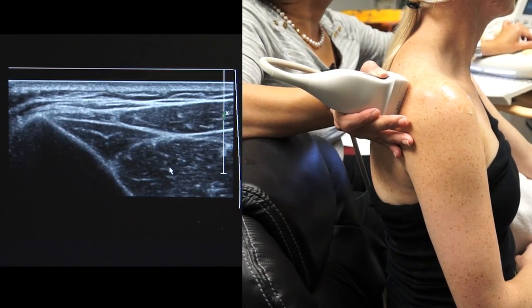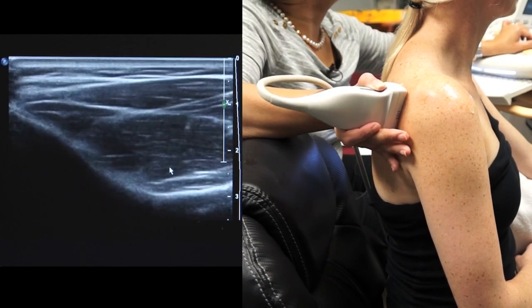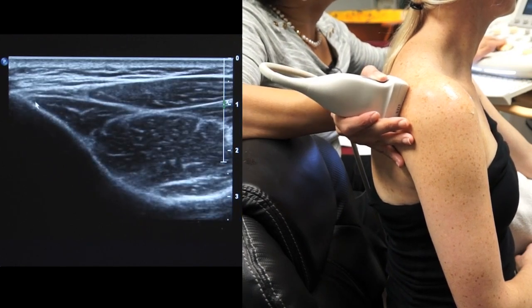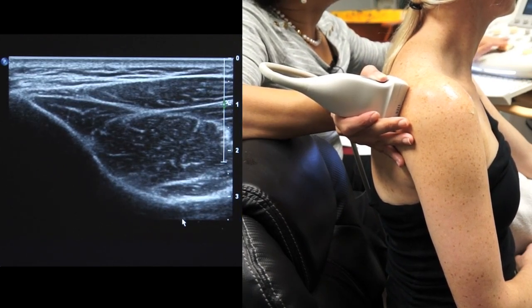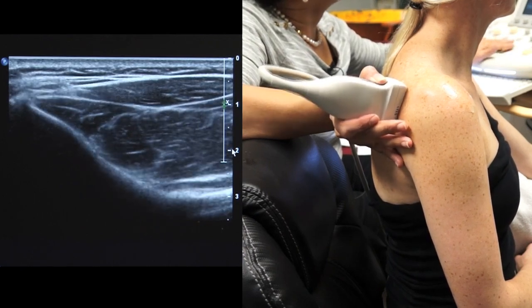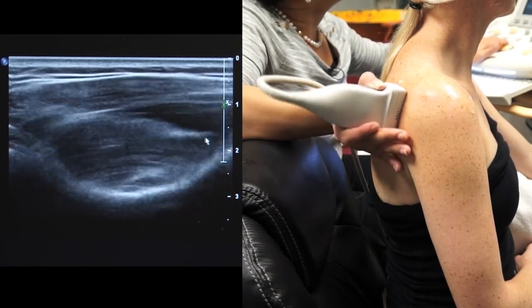I'm just going to adjust my depth so you can see most of the scapula here. So here's the scapular spine. Here is the scapula. And here's the infraspinatus and teres muscle.